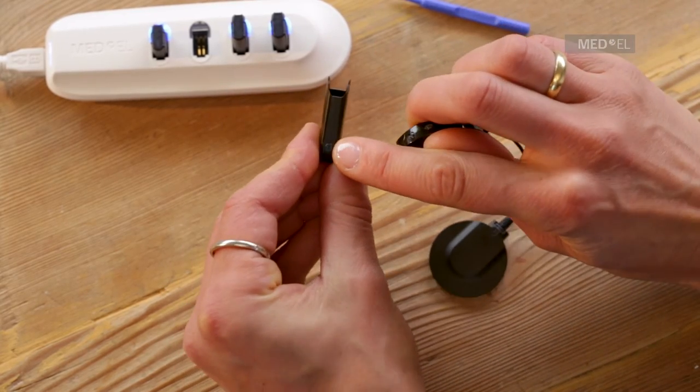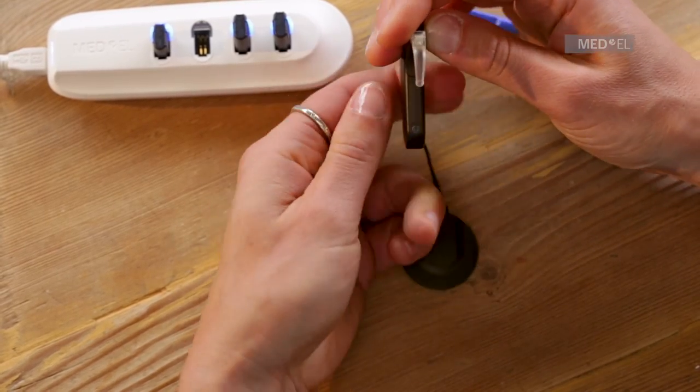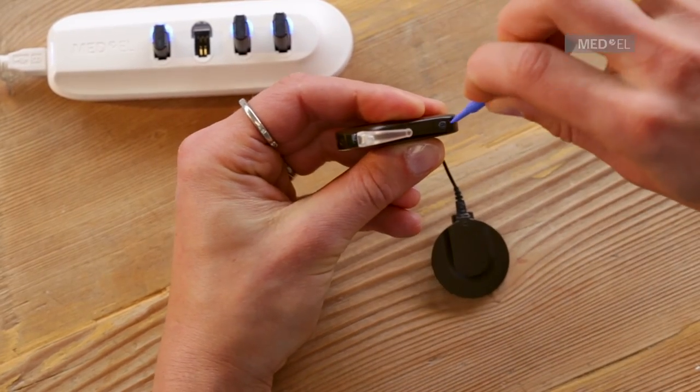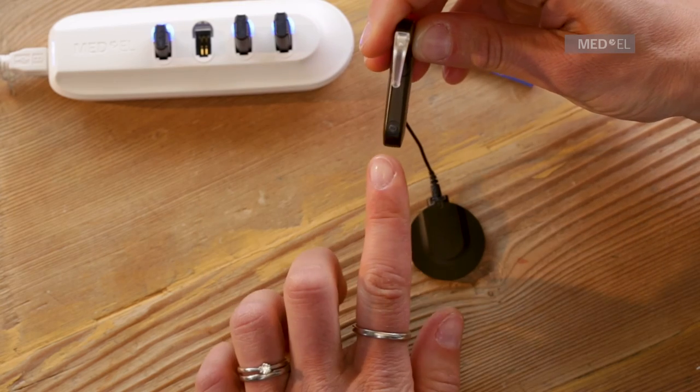Then replace the battery pack cover, ensuring it is in the unlocked vertical position. If you are using the micro battery, the smaller micro battery pack cover supplied in the kit should be used. For additional security, lock the battery pack cover into place using the plastic screwdriver.